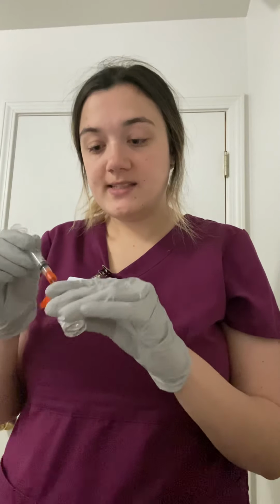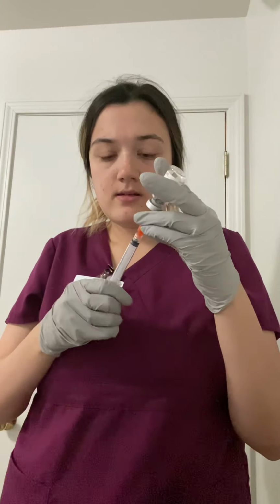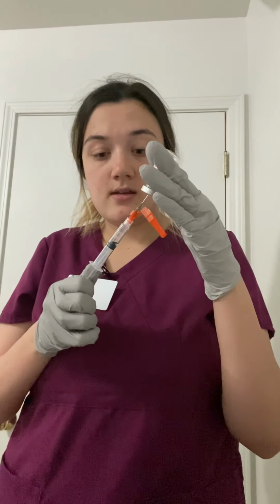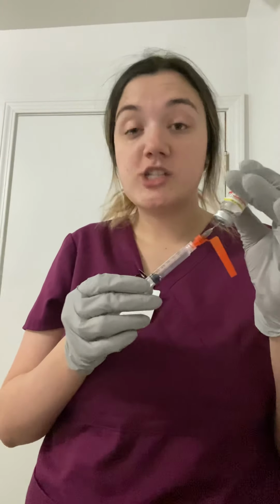So we're drawing up Lasix. I would be drawing up 4 mils according to the order. This is a 3 mil syringe. This is all that I have on hand, but we're going to pretend I drew up 4 mils.